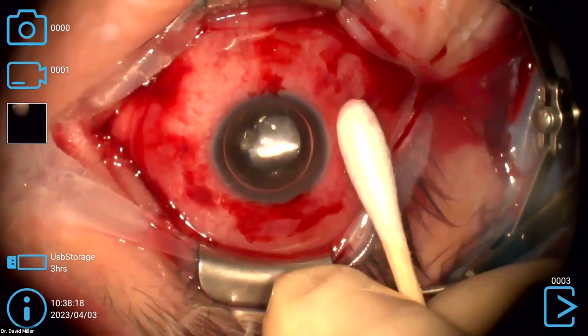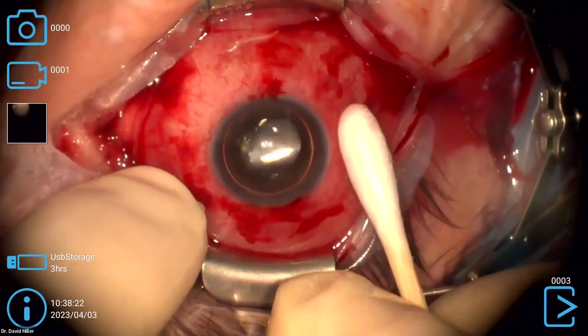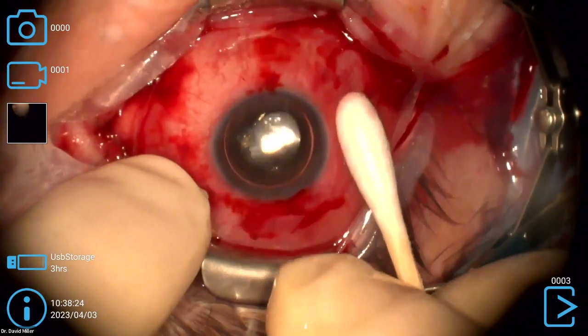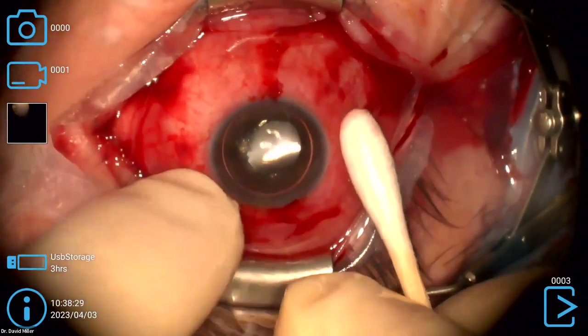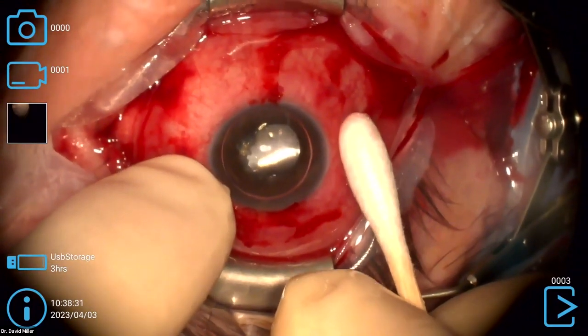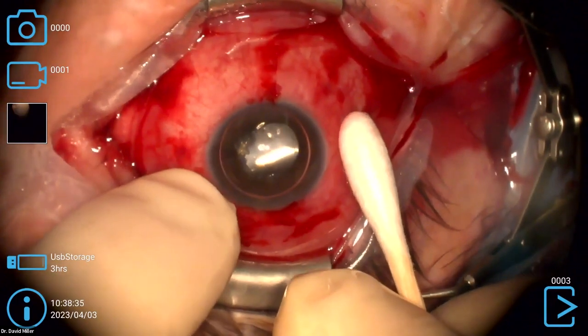So I'm going to hold a Q-tip here for a minute. A lot of times if you just wait, these wounds will swell up and close. But if that's not the case here, like the other two are closed, they're not leaking at all. If this one continues to leak, no hesitation to throw a 7-0 Vicryl suture through this to close it.